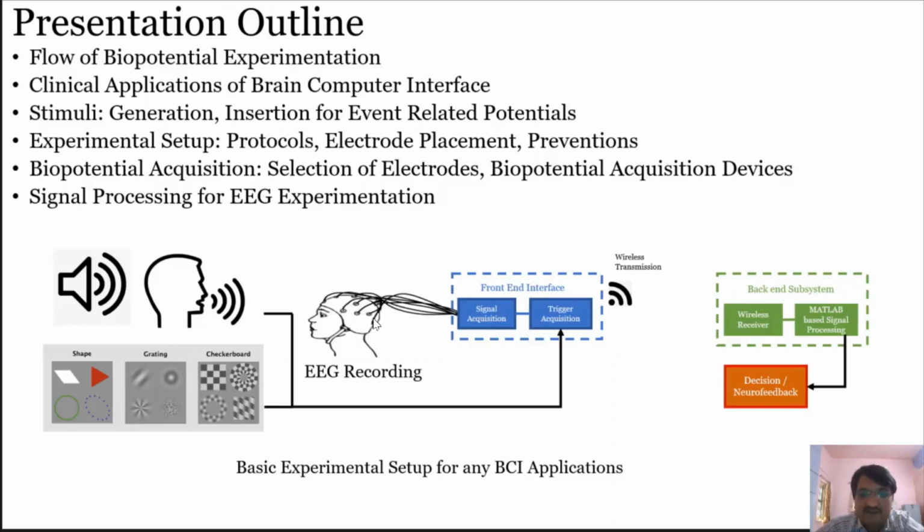Here in this image, a proper EEG cap is shown with electrodes placed on it. All these electrode recordings will be given to your signal conditioning circuits. I already mentioned that being very low in magnitude, it's very critical to obtain these EEG biopotentials. That is done with smartly designed electronics consisting of combinations of filters, amplifiers, and mainly an instrumentation amplifier.